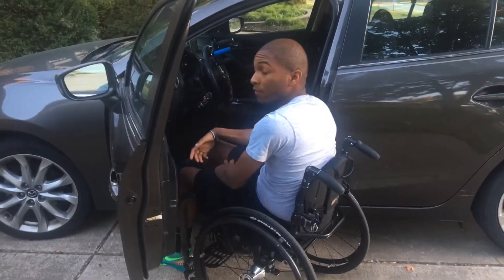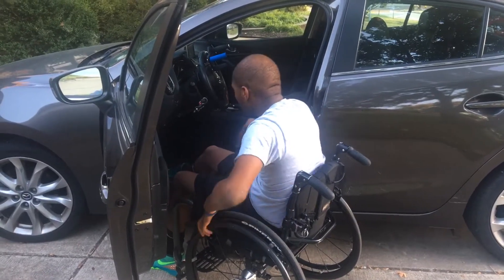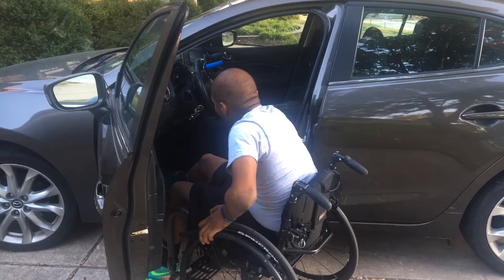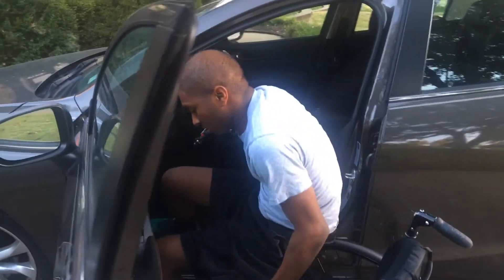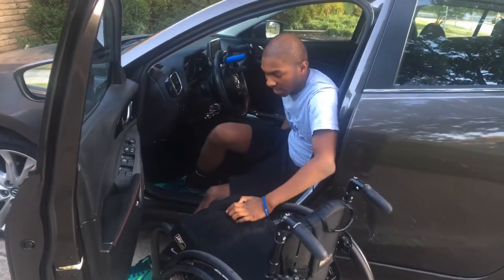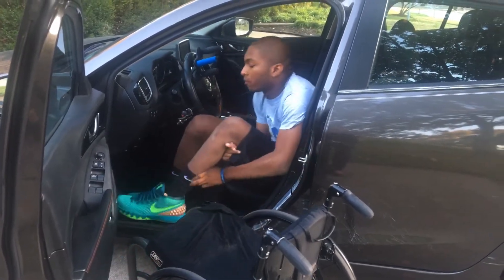I'll put my right foot in first and leave my left foot out, then do the normal transfer — put my left hand on the wheel and my right hand on the seat. Push to the end of my chair, then push in on the inside, and I can lift my leg up like that.